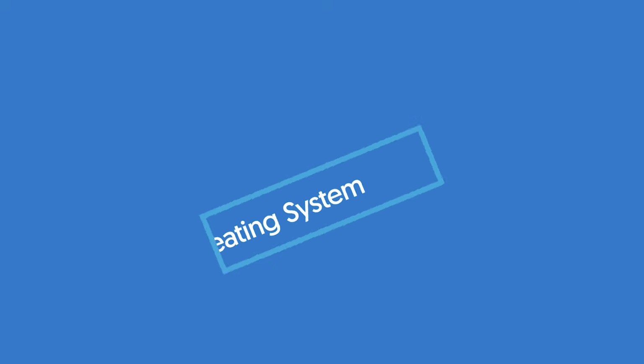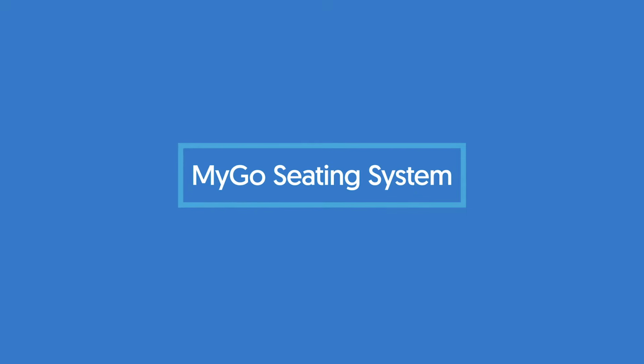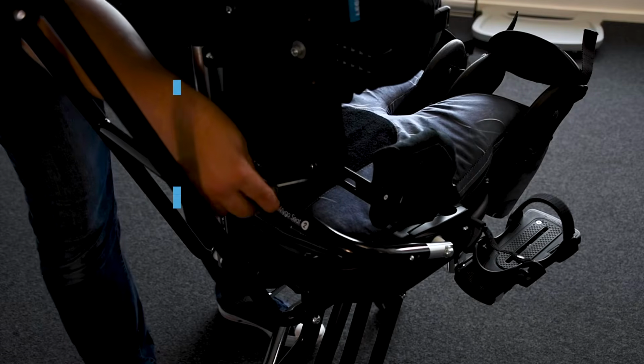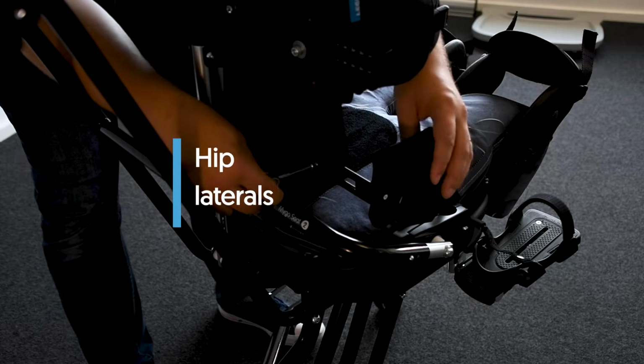Mygo seating system instructional video. Clinical setups for postural management. Hip laterals with pelvic cradle only.